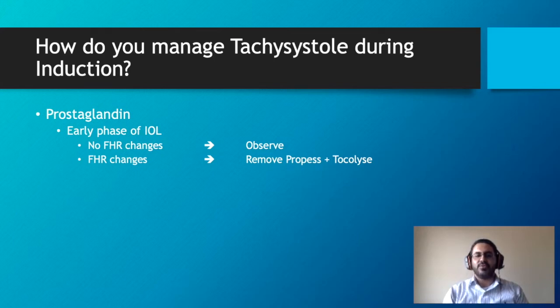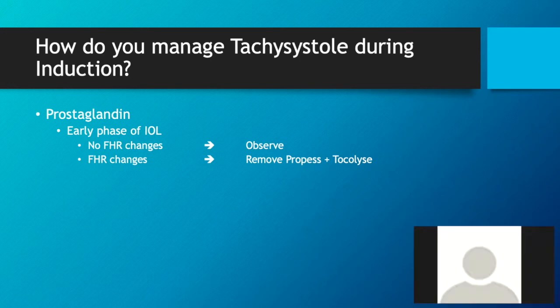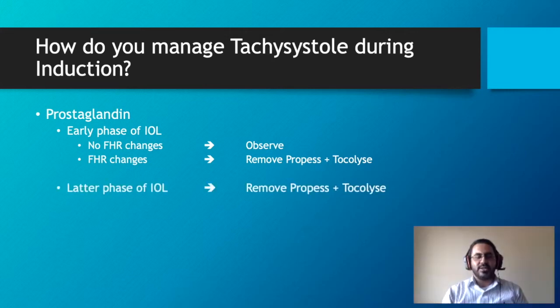This is happening in the early phase, so it makes a big difference how the baby is responding and how far along she is. It's very different from the lady who's had it later on and is now hyperstimulating and the baby is showing signs of hypoxia. That baby, you're going to settle, and then try another, gentler route than the prostaglandins.